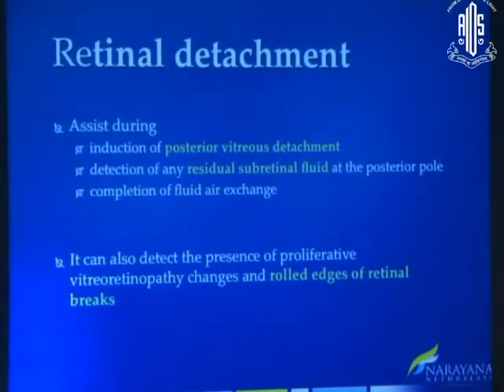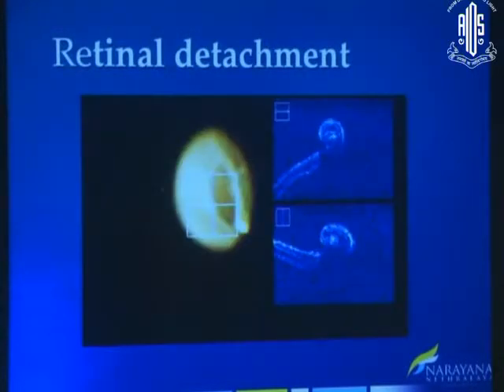In patients with retinal detachment, it can help us during induction of the PVD to see if there's any residual SRF present, and also for completion of fluid-air exchange. It can also detect the presence of PVR and the rolled edges of the retinal breaks. So here you can see we have imaged the edge of a retinal break with the rolled edges.